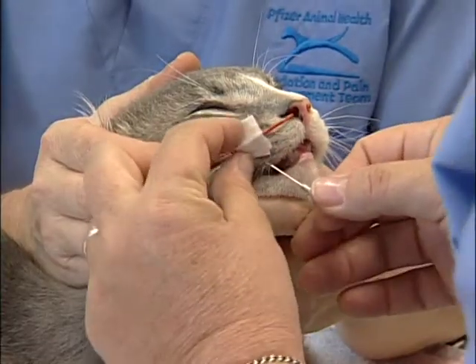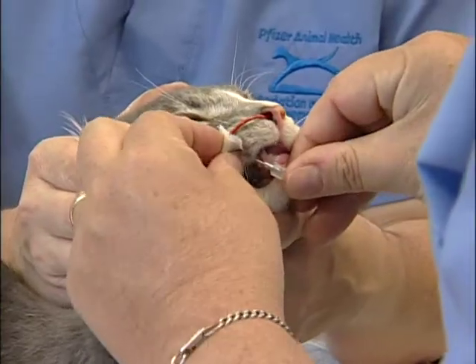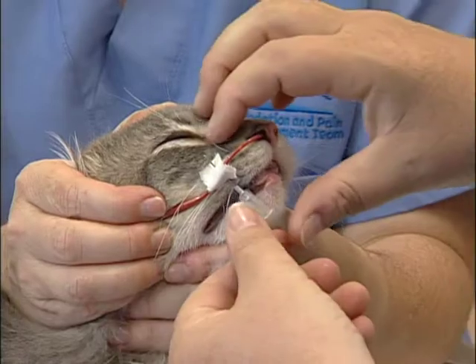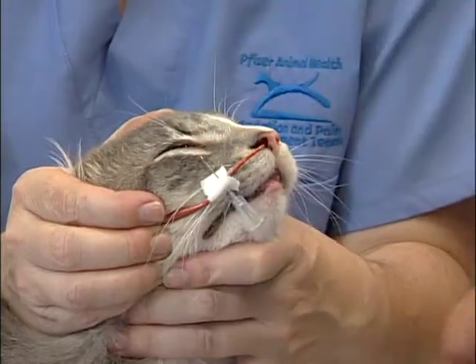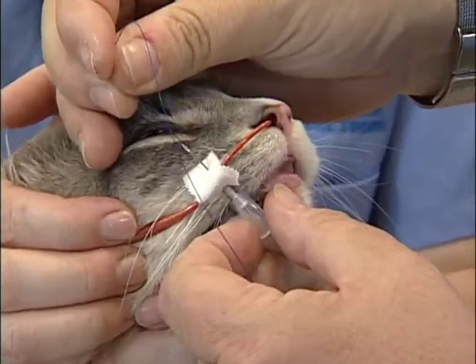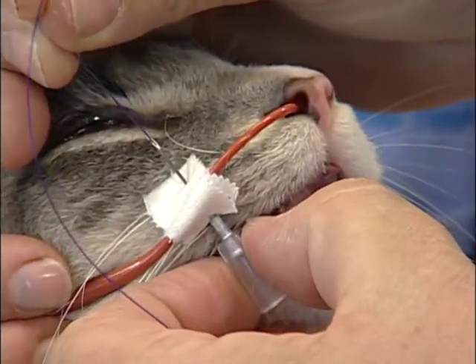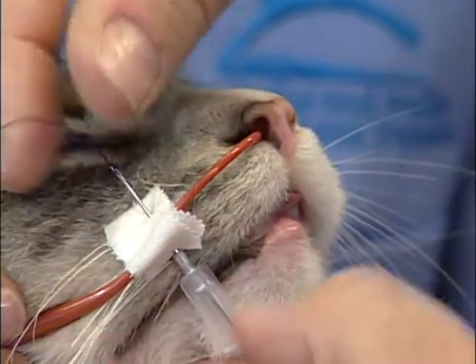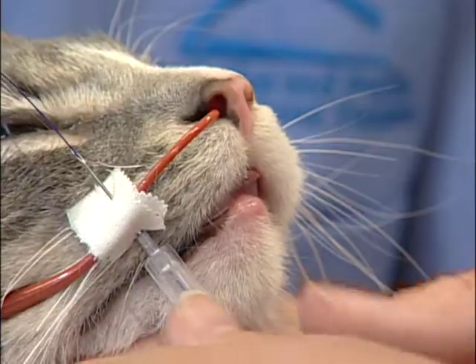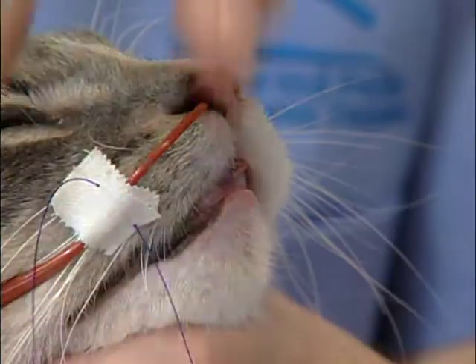We're going to insert this 22-gauge needle through the bottom half of the tape, catch a little bit of the cat's skin, and right through the top half. Then I can take my suture material, thread it right through the needle, and when it comes out the other side, I can just remove that needle and my suture is in place.